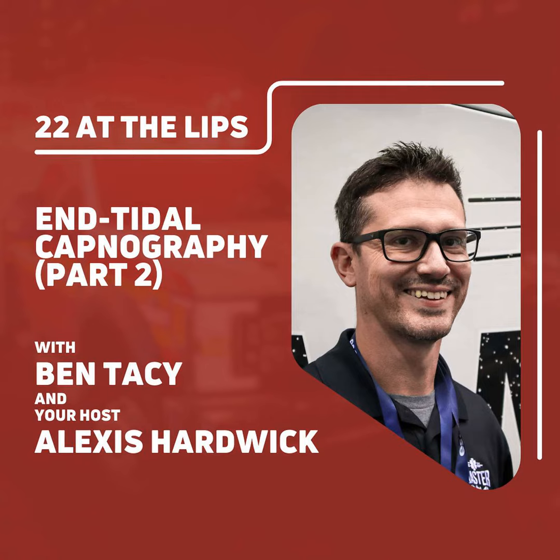And then end-tidal came up. I don't mean that as a caveat of, we'll just give all your trauma patients fluid boluses, because we all know what that does, and I don't want to go down that wormhole, but it helped to allow that circulation of waste and the body's natural buffering systems to occur as they should. So, like 300 to 400 mLs of fluid, got perfusion going back, heart rate came down, end-tidal came up, solid stuff.